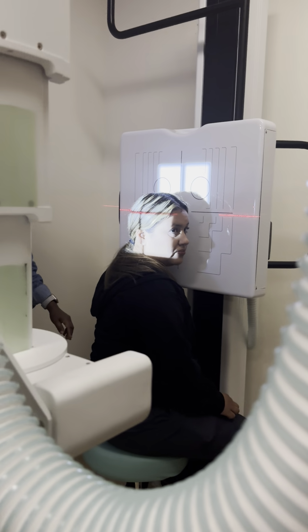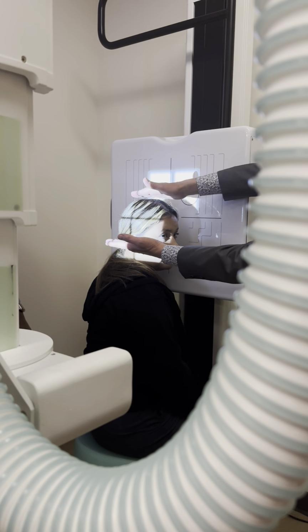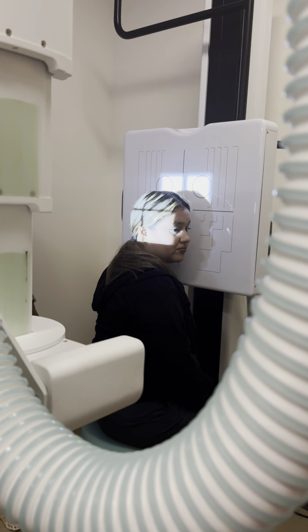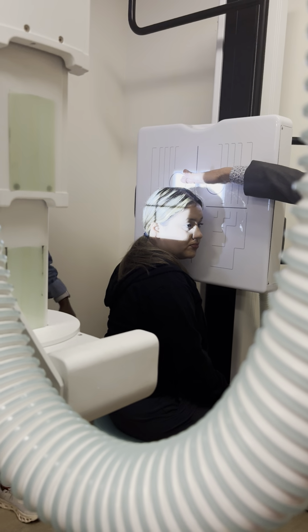Would you want to open it up wider? No, I just want the top of her head. I've got it way too open, by the way. The skull is only this part of the body. The rest of the mandible and everything else is facial bones or sinuses. So this is skull. You wouldn't want the whole facial. I don't want the mandible. I could collimate it down to here for you, Garrett, if I wanted to.